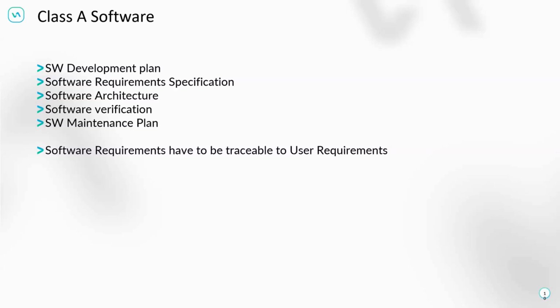For instance, lines of code per function, total number of functions, functions per file, cyclomatic complexity according to McCabe, all these kinds of simple and easy metrics which can be calculated very fast with a lot of tools.